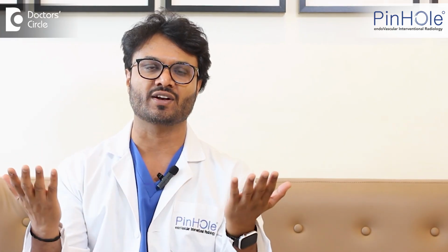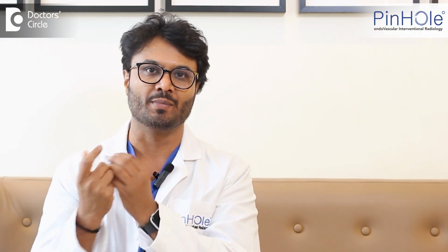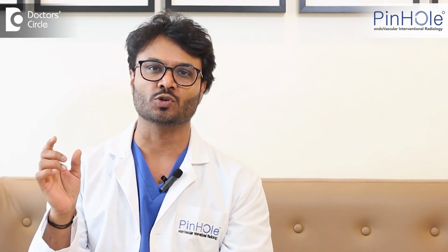Once this tissue is extracted, we send it for different kinds of tests to identify whether this sample is tumor or malignant tissue or a benign tissue or any infection. Similarly, if there is an infection or a pus collection somewhere, we put in the needle and remove the pus, and this is sent for infection workup. Many a time in our country, TB is very common, or any other infection. So we go inside in a guided way, which is the most precise, accurate way of removing a tissue without causing any damage.